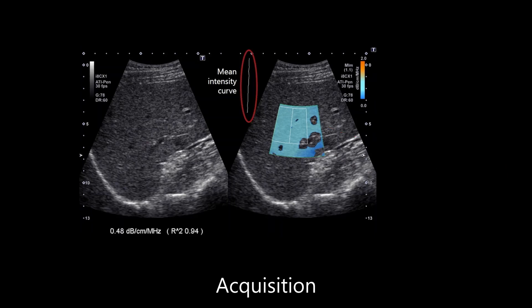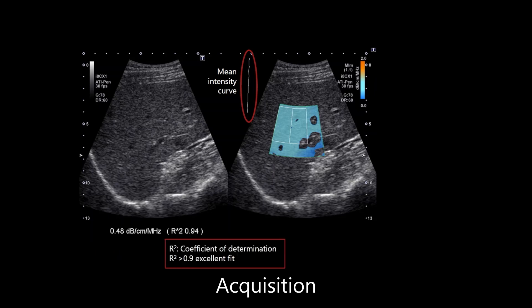The mean intensity curve is the average intensity along the depth direction within the measurement ROI, and is used to calculate the attenuation coefficient displayed at the bottom in units of dB per centimeter megahertz. The quality of your acquisition is important to provide diagnostic confidence. Quality can be confirmed via the coefficient of determination, or R-squared value.